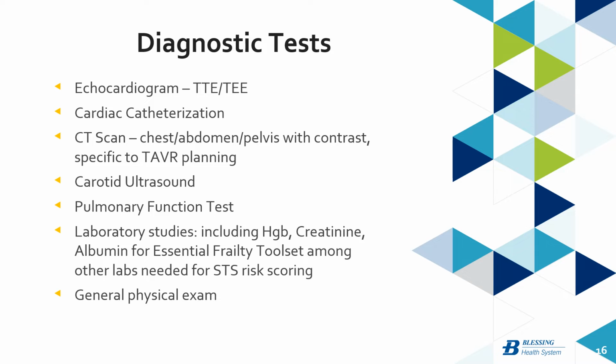They all do have a heart catheterization, so we do a right and left heart catheterization and often try to cross the valve and take direct measurements of those gradients during the heart cath. This is for a few different reasons. One, right-sided heart cath for PA pressures, but we also want to know if they have any coronary artery disease, and then decide when we intervene. If it can be done with a PCI, do we do that before or after the TAVR? All that gets taken into consideration. If they have multivessel disease, that changes the conversation altogether. They are referred on to CT surgery, who can do the CABG and AVR at the same time.